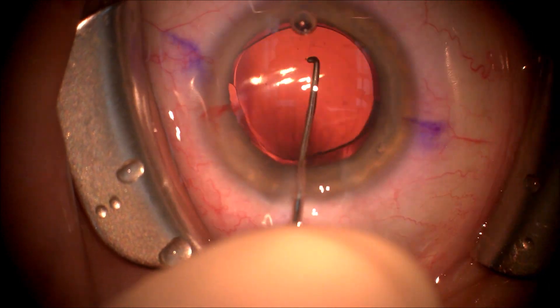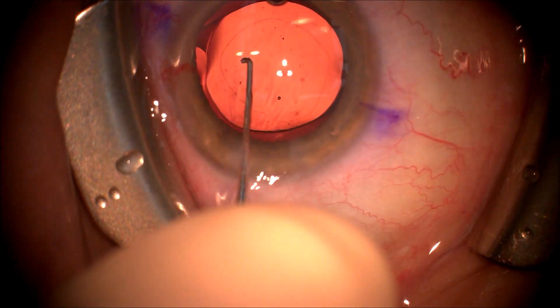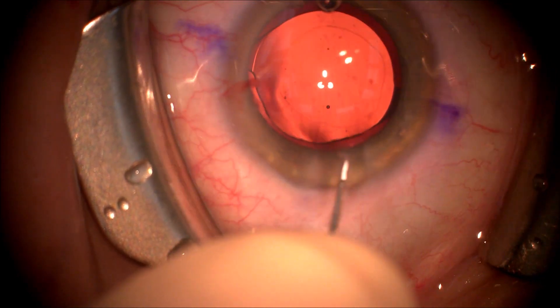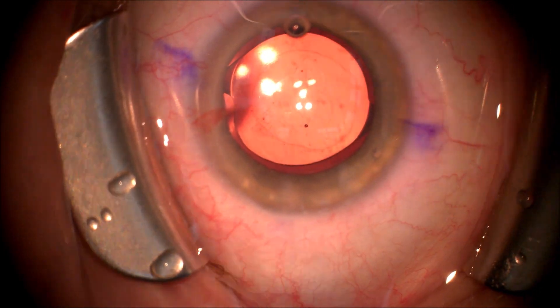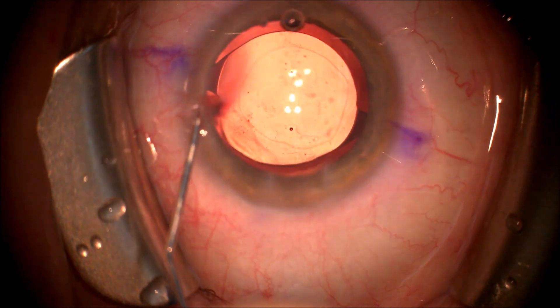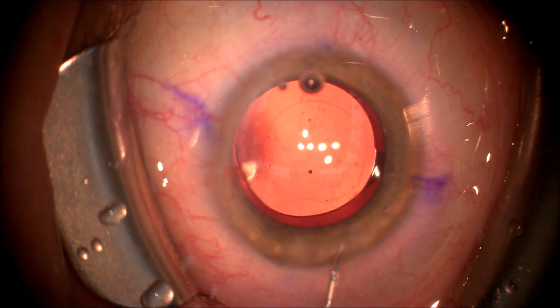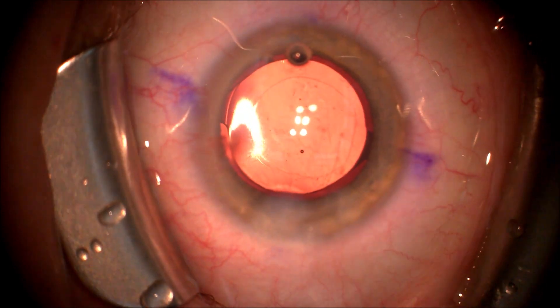Once the lens is in the capsular bag and the haptics are in good position, we will hydrate the incisions starting with the side port incision and then hydrating the main incision to ensure a leak-free wound at the end of surgery.